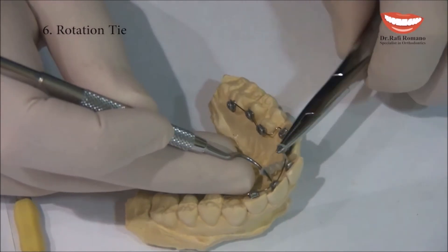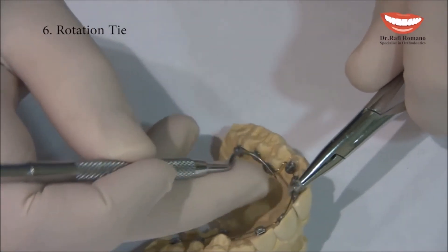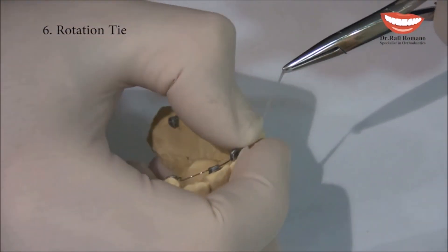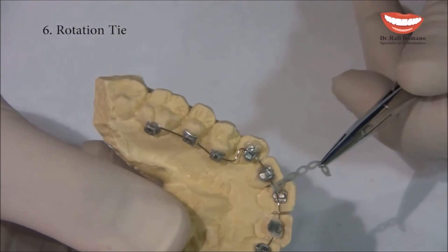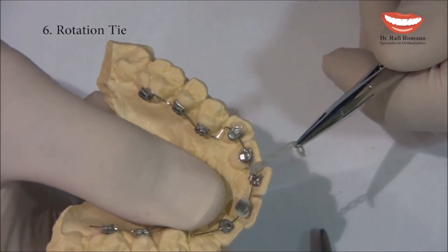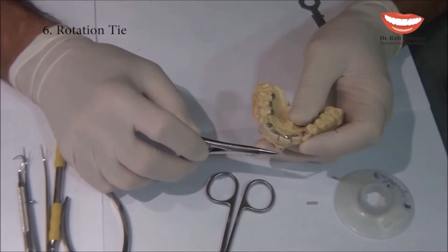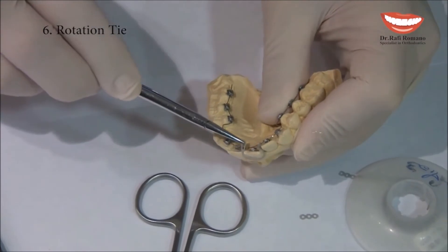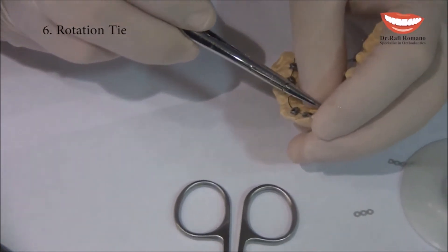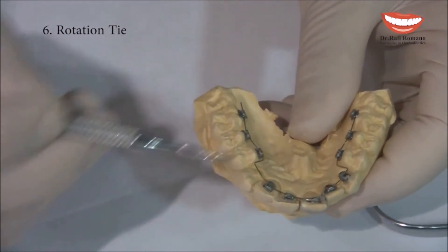Then we open the mosquito and get the other side of the chain, and we pull it together. Now we get a power chain which is connected to the wire. Now we can pass it through the contact point, around the tooth, going under the next contact point, and then connect it to the bracket.